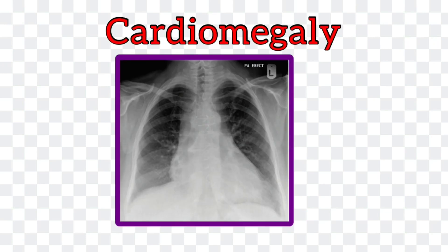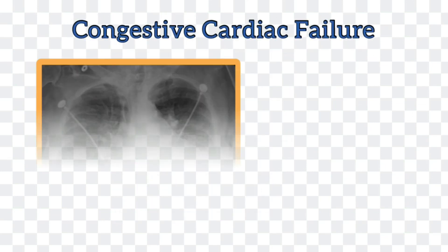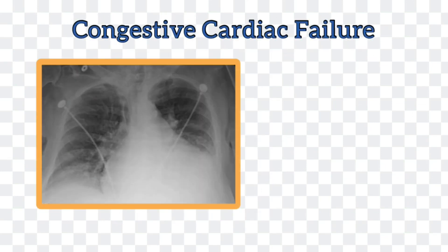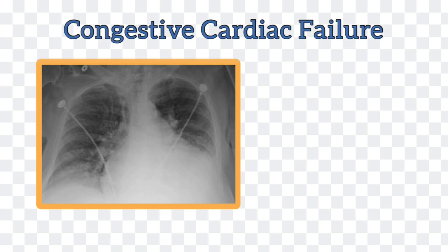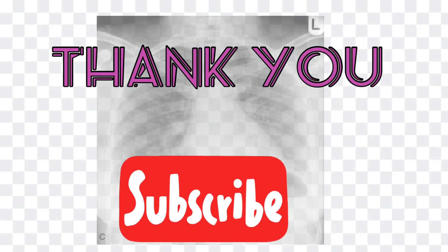Now look at this x-ray showing cardiomegaly. As already mentioned, cardiomegaly should never be commented upon in an AP chest x-ray. Cardiomegaly is present if the maximum diameter of the cardiac shadow is more than half of the transthoracic diameter at the broadest part of the chest. In a classical chest x-ray of congestive cardiac failure, there is cardiomegaly, evidence of pulmonary edema, evidence of pulmonary hypertension, and there can also be presence of pleural effusion. I hope this was helpful. Thank you.